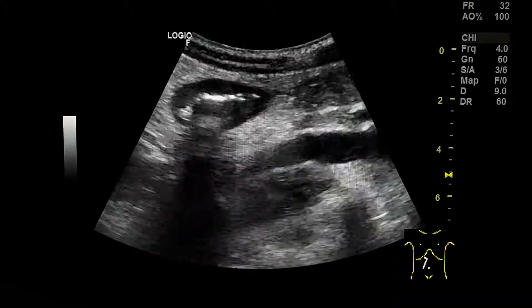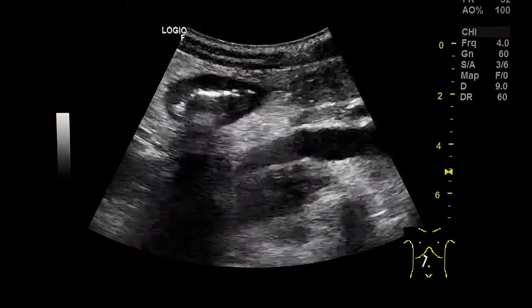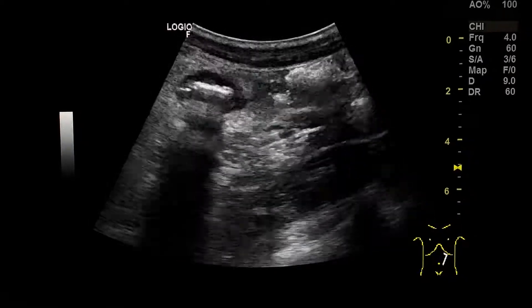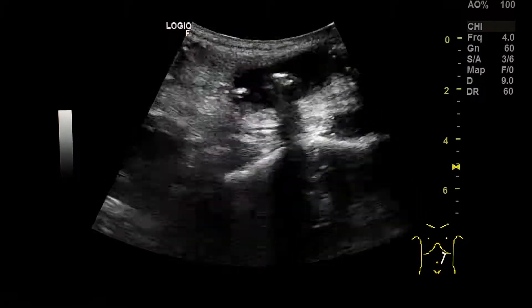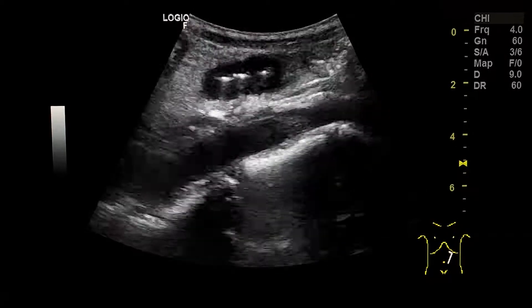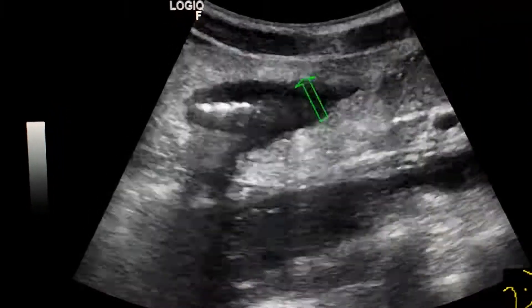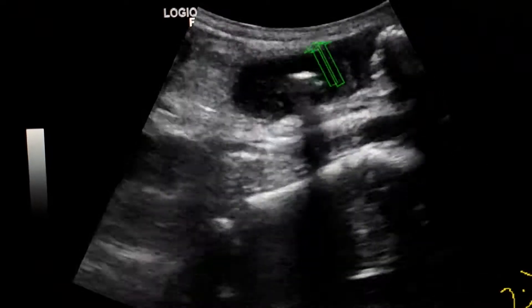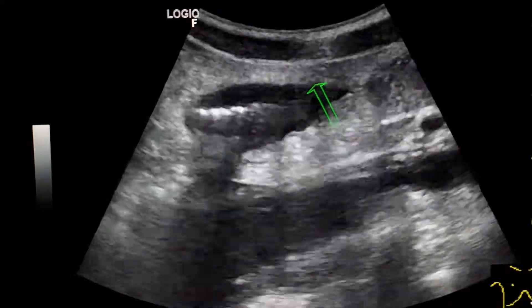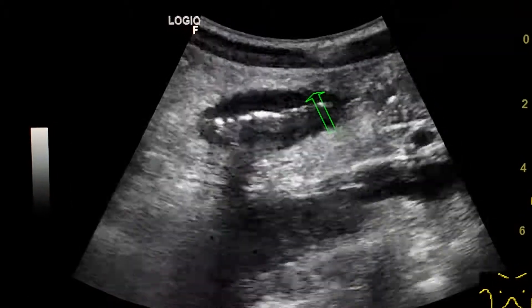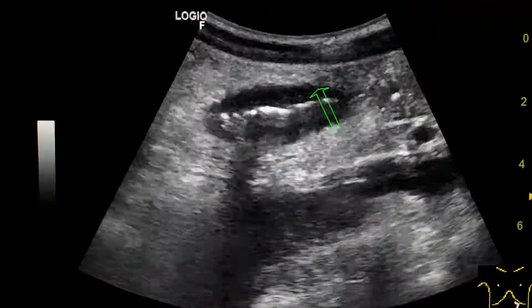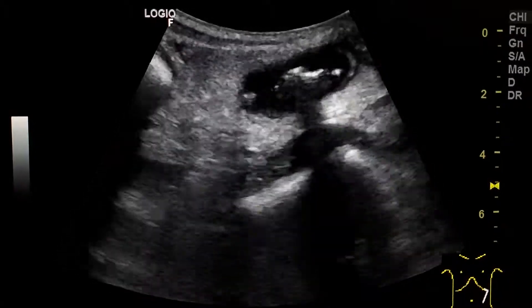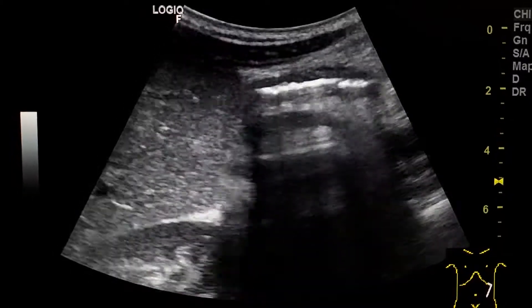This is an ultrasound exam of a 24-year-old male patient with a chronic history of diarrhea, diagnosed as ulcerative colitis by colonoscopy and biopsy. This is the thickened transverse colon. The thickened hypoechoic wall is surrounded by echogenic fat, which is the mesocolon and the mesenteric fat around it. This is the transverse colon at the level of the splenic flexure.